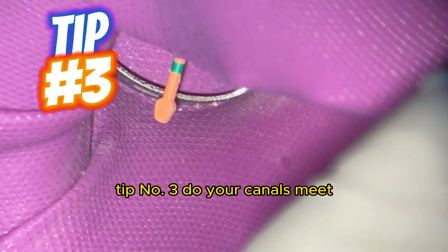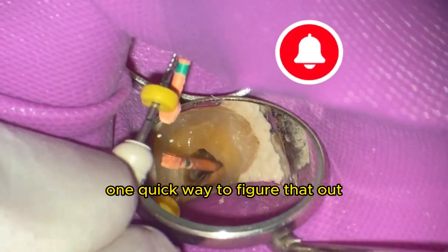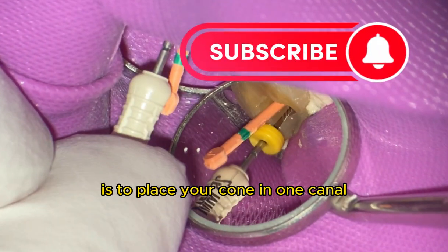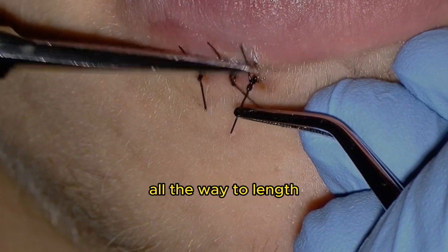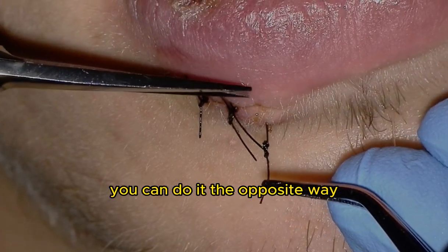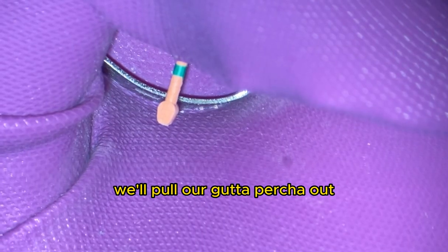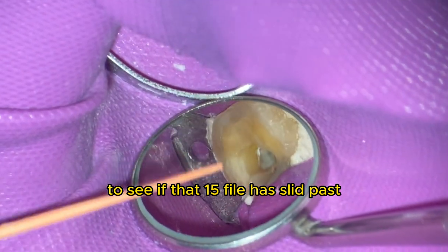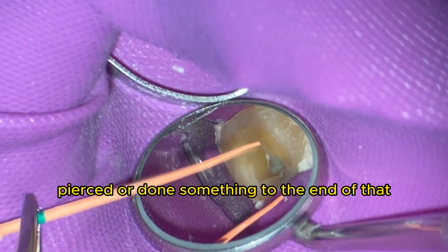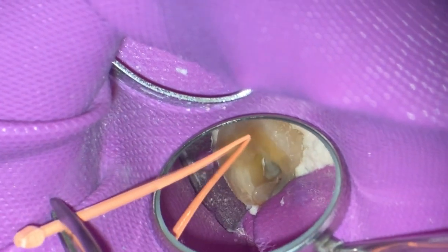Tip number three: do your canals meet? Are they confluent? One quick way to figure that out is to place your cone in one canal. The cone is in MB2, and I'm placing a size 15 file in MB1 all the way to length — you can do it the opposite way. We'll pull the gutta-percha out and look under high magnification to see if that 15 file has slid past or pierced the end of that gutta-percha piece.